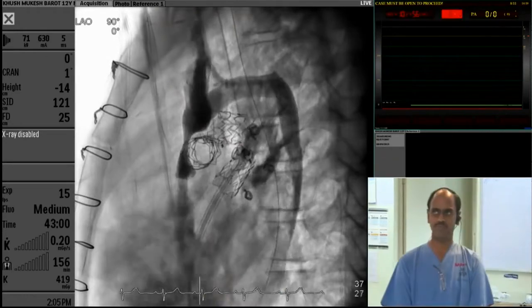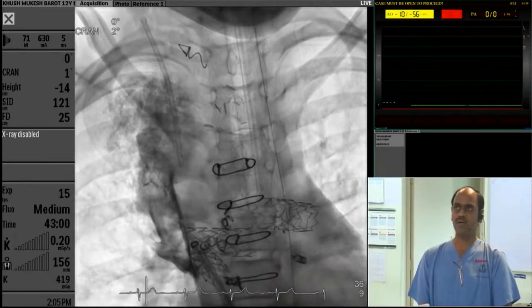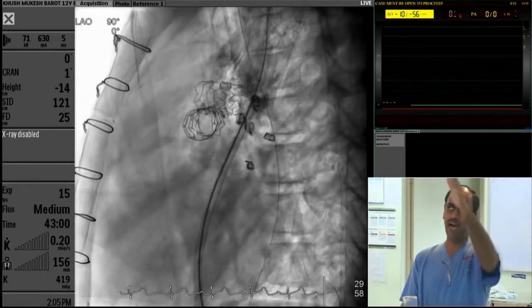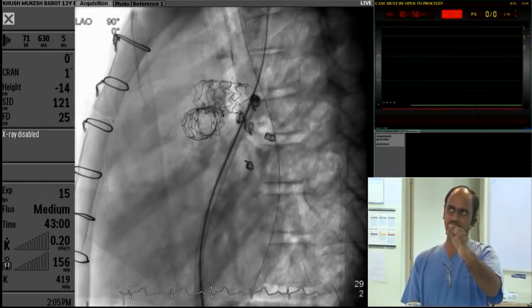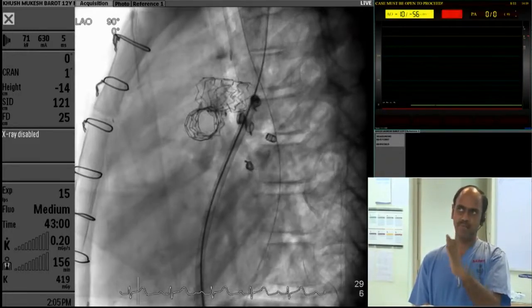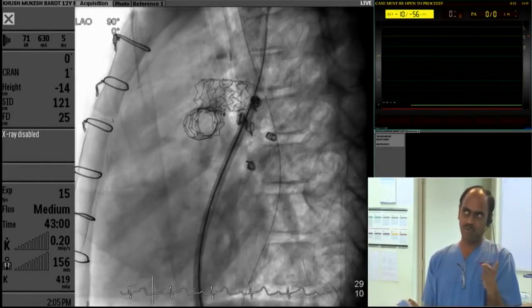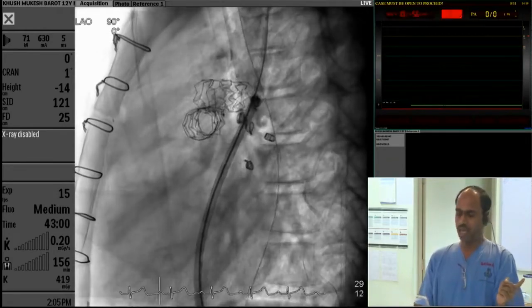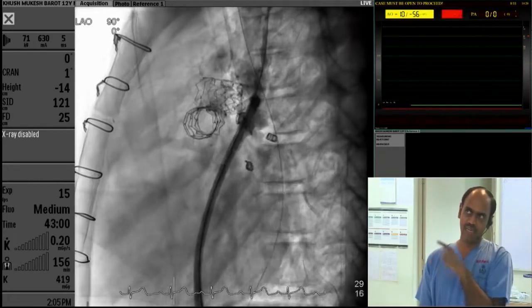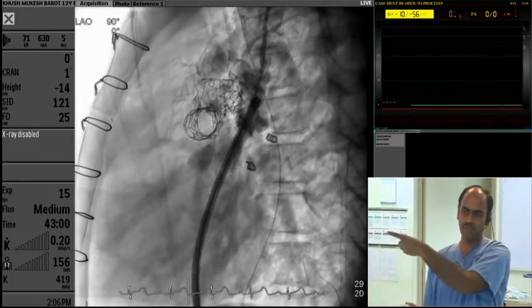Now tell me what is wrong — the stent is not in the right place. I will tell you: the basic principles were not followed at all in this step. I pushed my catheter up inside, saw a pressure of 20 to 25, and thought it was superior vena cava. I pushed the sheath inside. I did not recognize that I was posterior to the right pulmonary artery. The superior vena cava is anterior to the right pulmonary artery. The reason I was misled: number one, the pressure was high; number two, the azygous confounded me. In fact, I was crossing the PFO, entering into the pulmonary vein, and injecting in the pulmonary vein. The left atrium was filling, not the right atrium. The left ventricle was filling. I was completely overlooking that because I had a superior azygous vein that was filling.